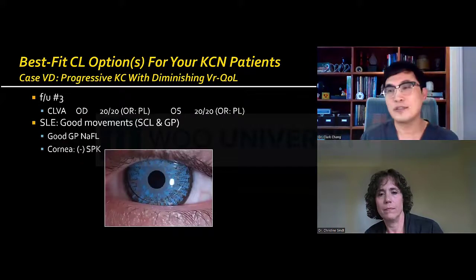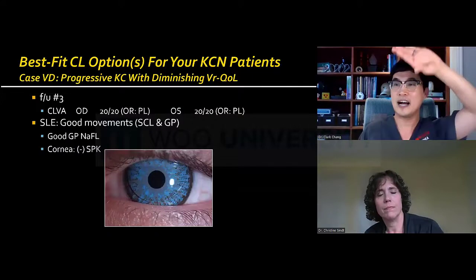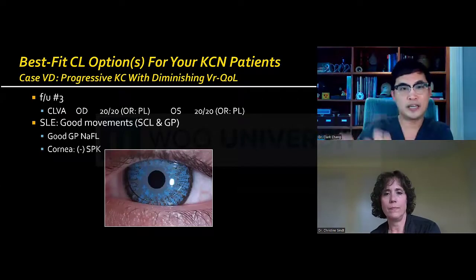And so eventually I had to put him in, and you can see with the same GP, this one is more centrally located with piggybacking with a prosthetic lens right up, right? Because now it's fitting over the elevation profile, combining with the lens, not just the cornea.